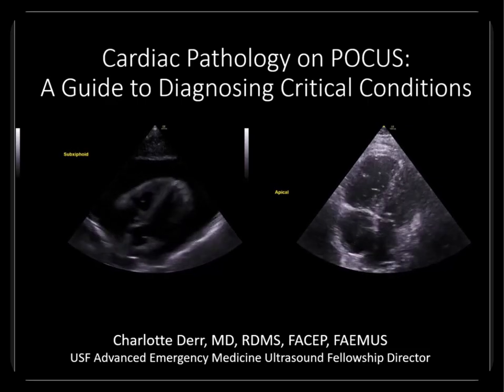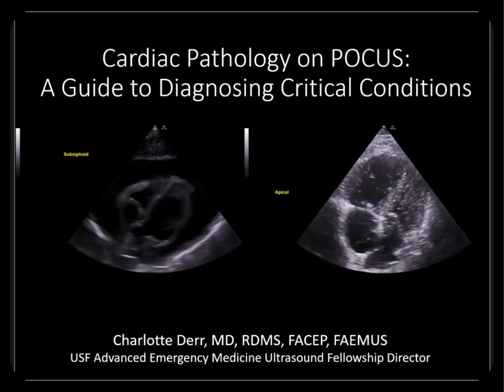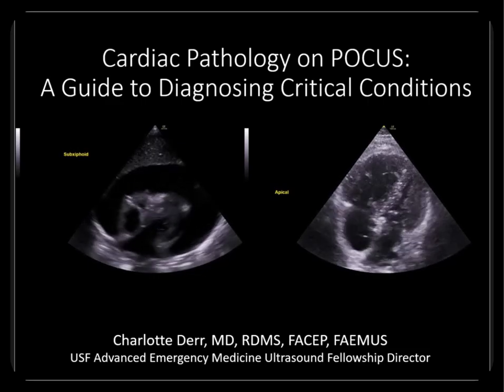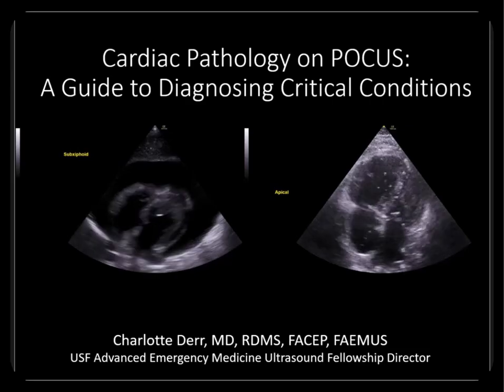In this lecture, I will not be reviewing how to obtain the basic echo windows, nor will I be going into detail about echocardiographic anatomy. If you are a novice POCUS user, I hope you will watch our Introduction to Cardiac POCUS lecture by Dr. Martinez prior to viewing this lecture. I have no relevant financial disclosures.